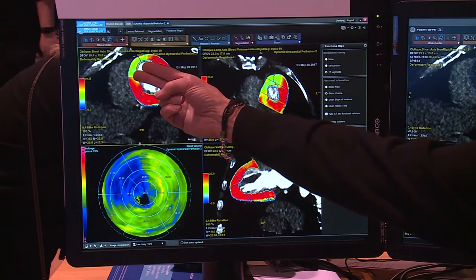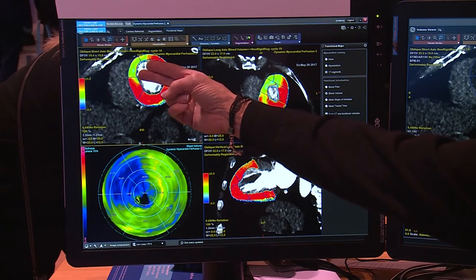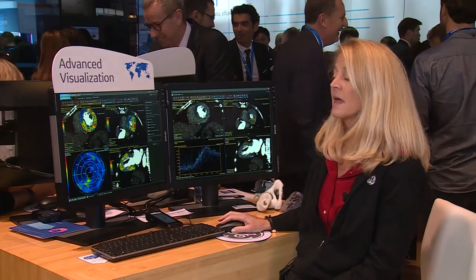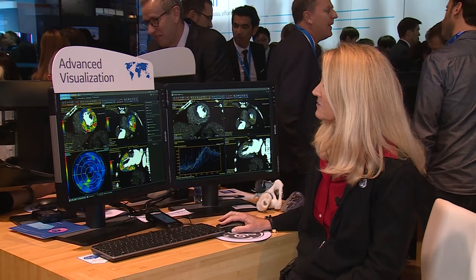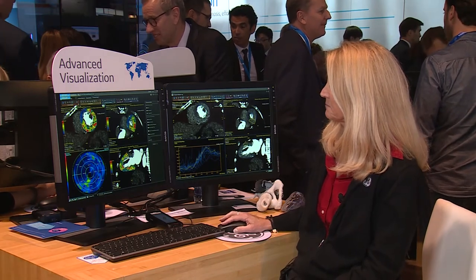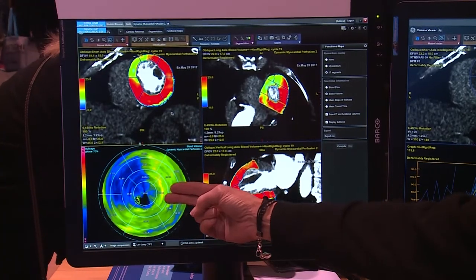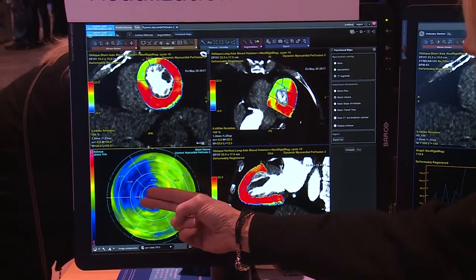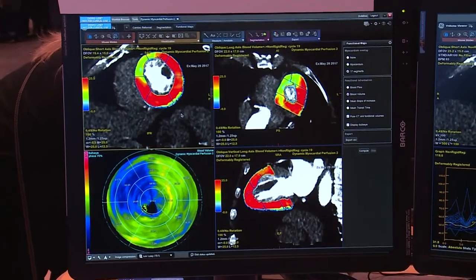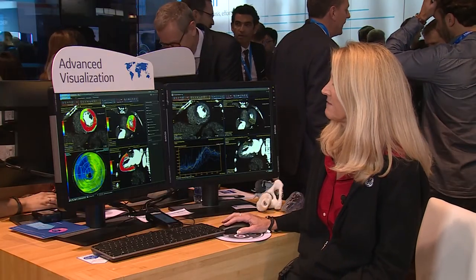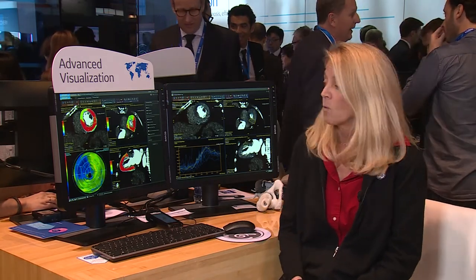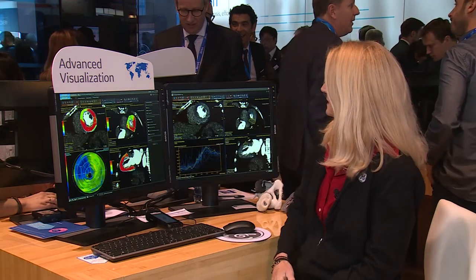We now have our color overlay and we can see qualitatively where our deficit is in the myocardium. For this exam, I can see it very nicely here in this segment. We also get a bullseye plot that shows us where the abnormality is. I can move to blood volume and very nicely see where the defect is, and I can also see it on the bullseye plot.